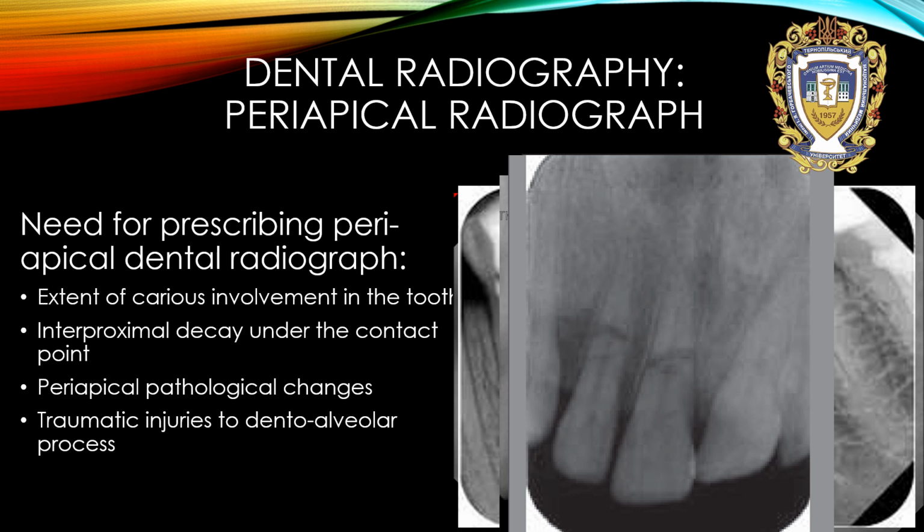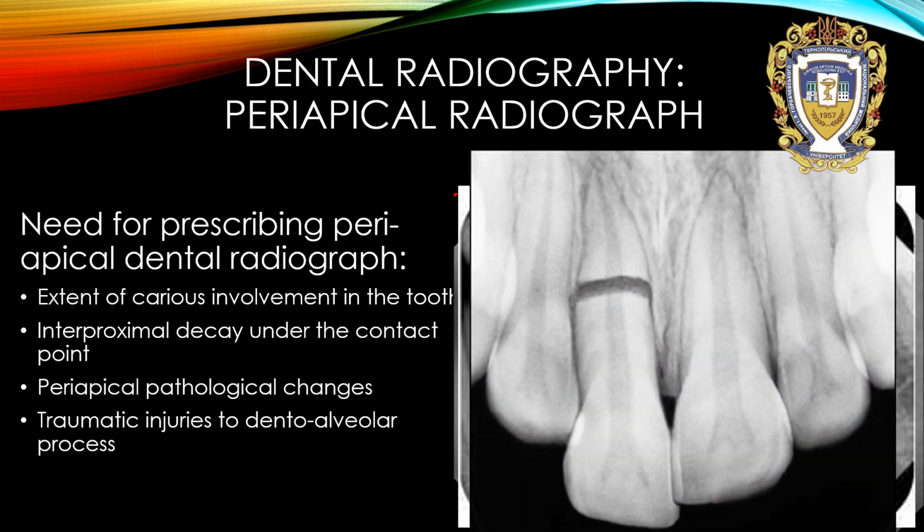Another X-ray, fractures in the middle part of the roots, teeth number 1-1-1. Another example, fracture of the middle part of the root, tooth number 1-1.